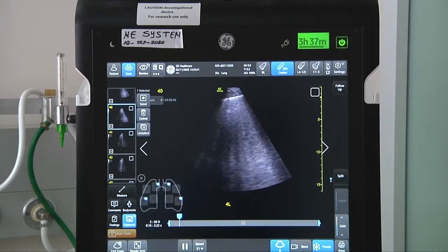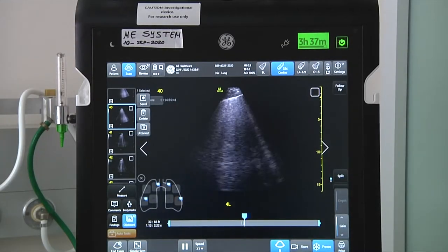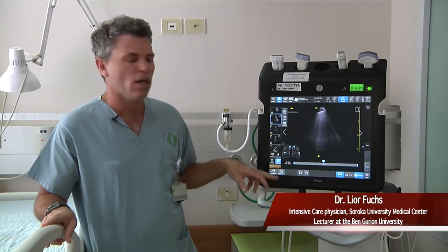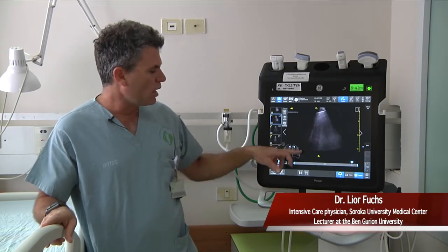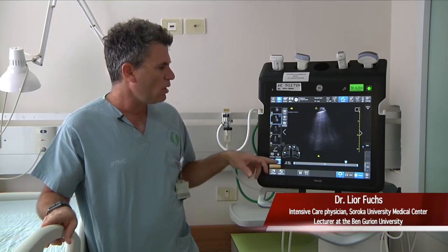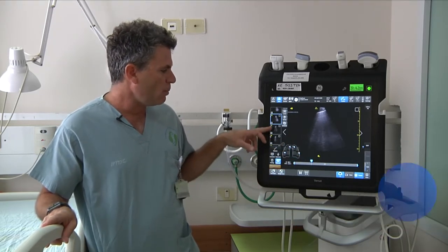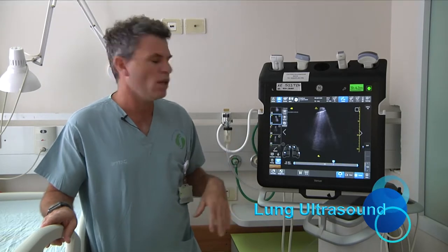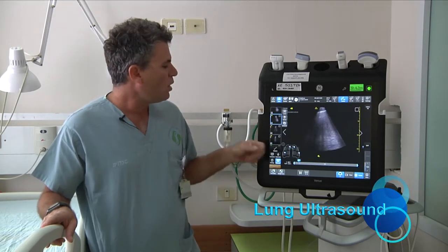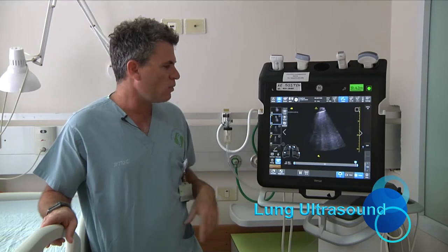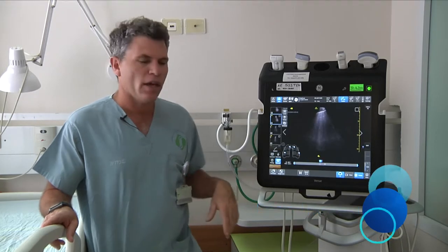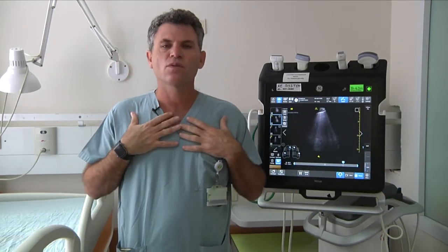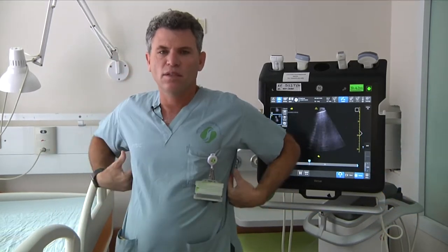When we scan the lungs, we have a very rapid description of where we are. You can see the lung diagram here, and in any picture that we choose when we review the study, we can know exactly where we are scanning right now — either the Z1 zone, the anterior zones, or the dependent zones.